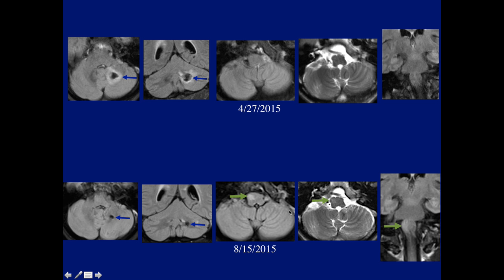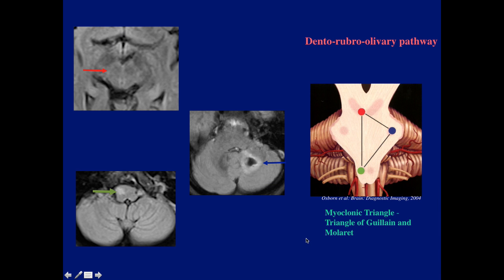As you can see, the dentate is abnormal on FLAIR and T2 images. Again, this case shows the typical findings of the myoclonic triangle: involvement of the dentate, maybe the red nucleus shows a little more signal than the opposite side, and the olivary changes.